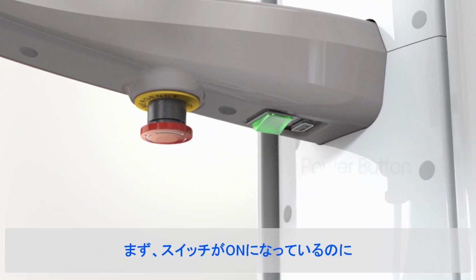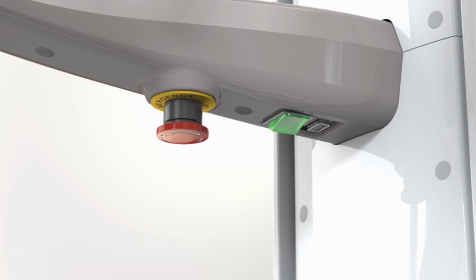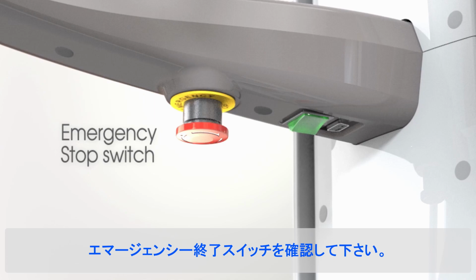First, please turn on the switch. If the machine is not working, although the switch is on, please check the emergency shutdown switch.